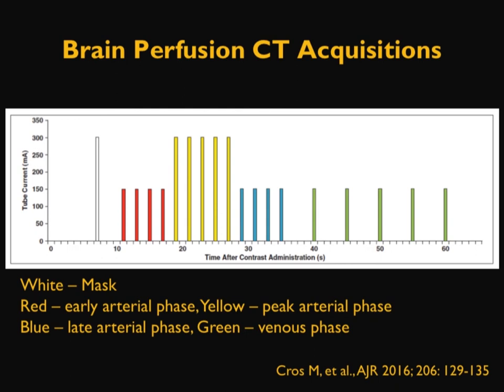Together, approximately 4 plus 5 plus 4, about 13 acquisitions, are done over a period of 10 to 40 seconds post contrast injection. Then afterwards there is a delayed phase during which a delayed acquisition occurs multiple times.